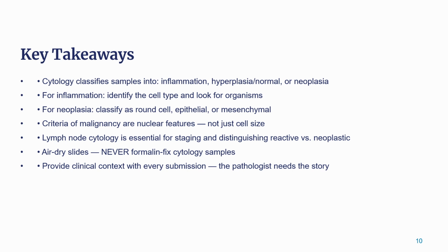Cytology is one of the fastest, most rewarding diagnostic tests in practice. A well-made slide with good clinical context can give you an answer in 24 hours that changes a patient's outcome.